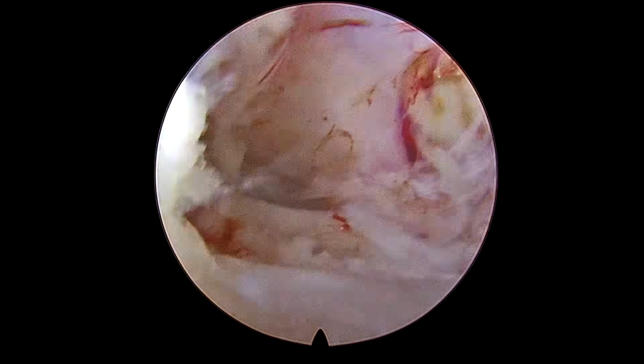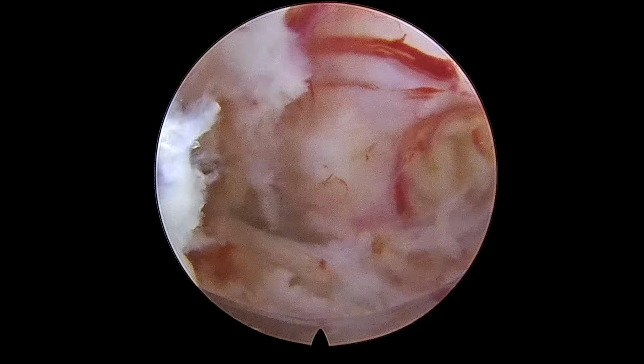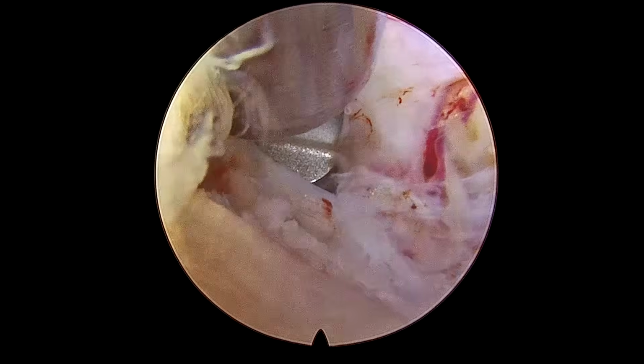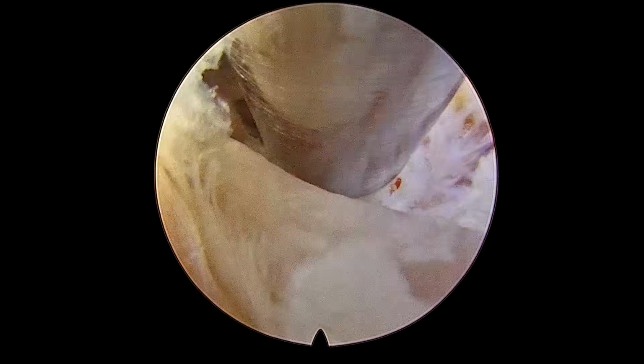Again the philosophy is the same. Whenever you see any bleeder, try to catch it. You can see here gradually we are now able to see the shoulder area as well.